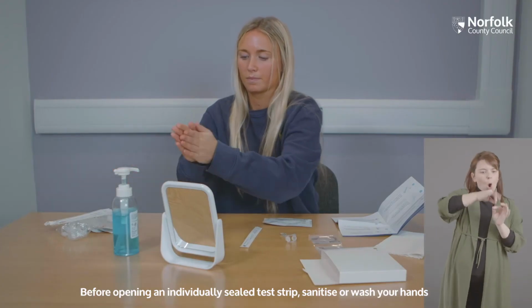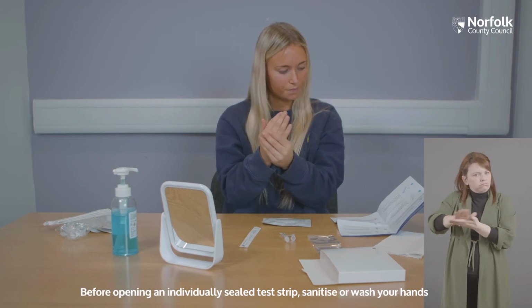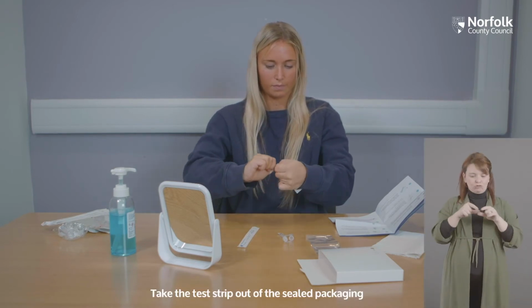Before opening an individually sealed test strip, sanitize or wash your hands. Take the test strip out of the sealed packaging.